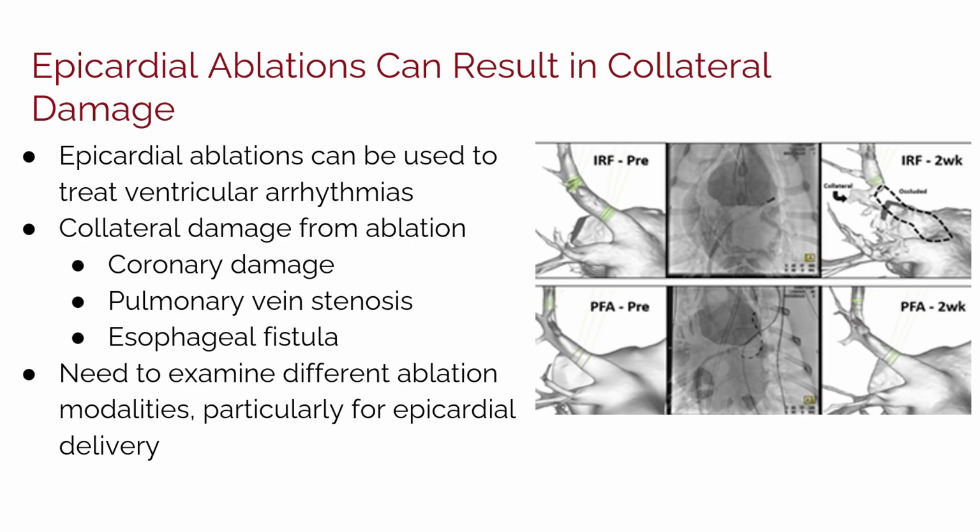However, in this study, we aim to look at the acute response of irreversible electroporation versus radiofrequency ablation modalities in order to see how the coronary vessels respond.